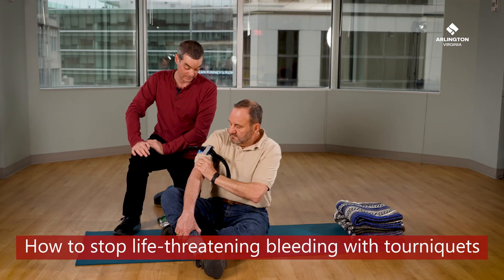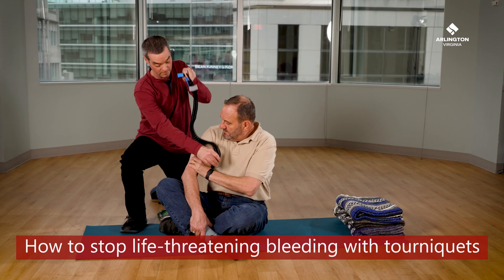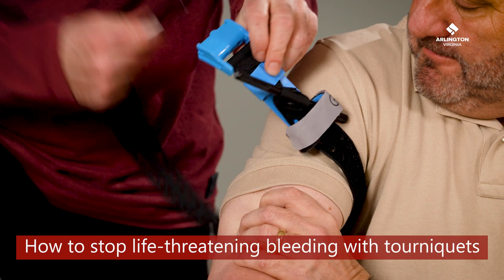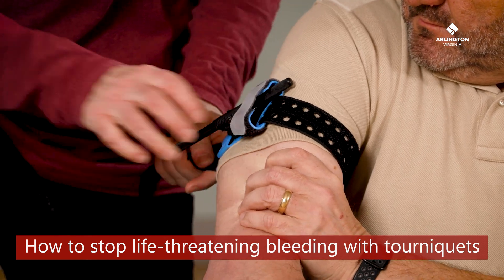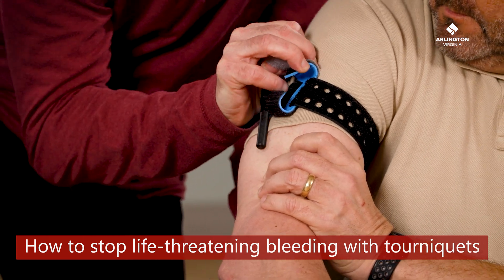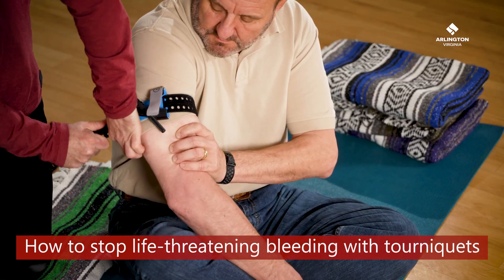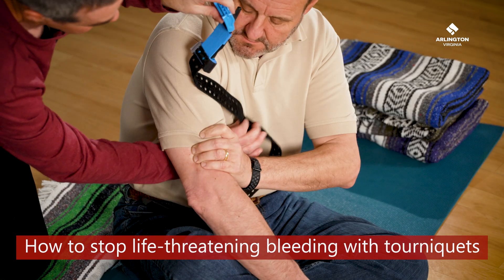Most tourniquets consist of a strap, a buckle to hold the strap in place, and a handle called a windlass for twisting. Always place the tourniquet as high up on the limb as it can go without being on the joint. Place it high since you may not be able to see all of a person's injuries. In an emergency, it's better to stop blood flow to the entire limb.